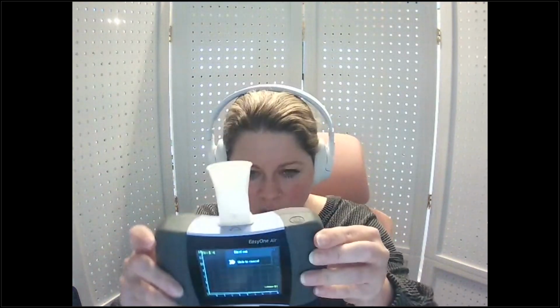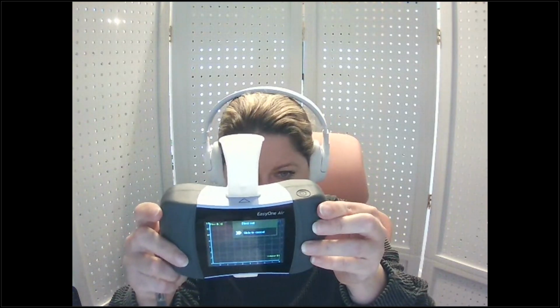And I will click OK. And then very quickly, we'll hear an auditory cue. There are happy beeps. You'll hear me say that quite a bit. And the coaching bar is telling us to have the patient blast out. So good tight seal in the mouthpiece, big breath in, blast it out.